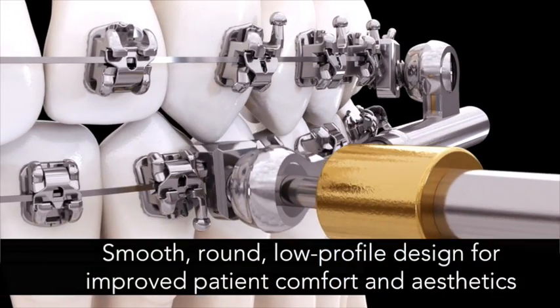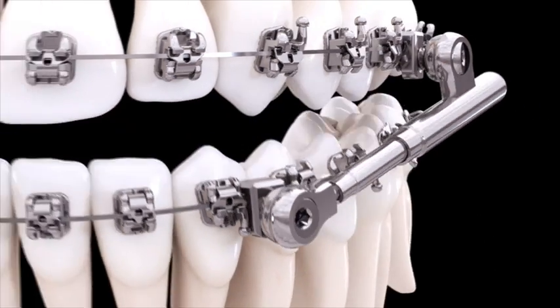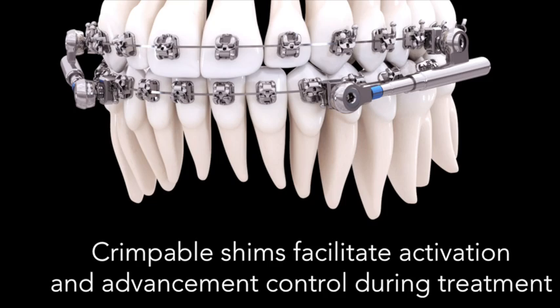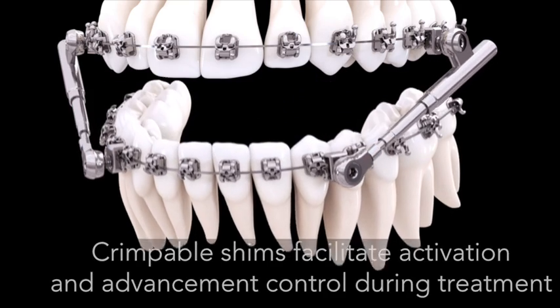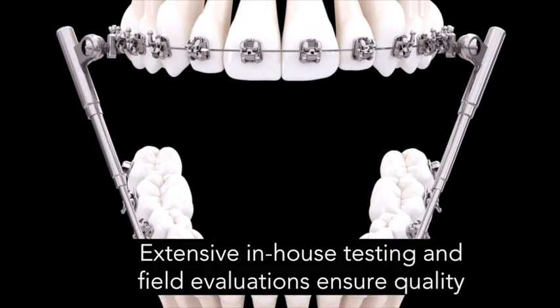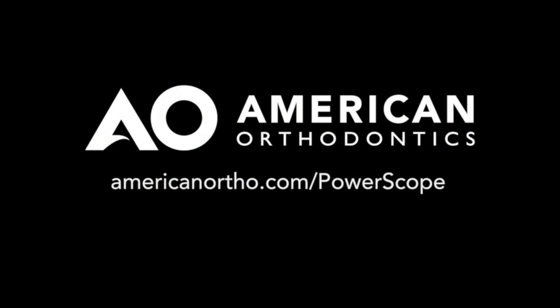Once installed, PowerScope's smooth, round, low-profile design helps improve patient comfort and aesthetics. Crimpable shims facilitate activation and advancement control during treatment. AO ensures the highest quality standards through extensive in-house testing and field evaluations. To learn more about the PowerScope Class 2 Corrector, contact your American Orthodontics sales representative or visit www.americanortho.com/PowerScope.